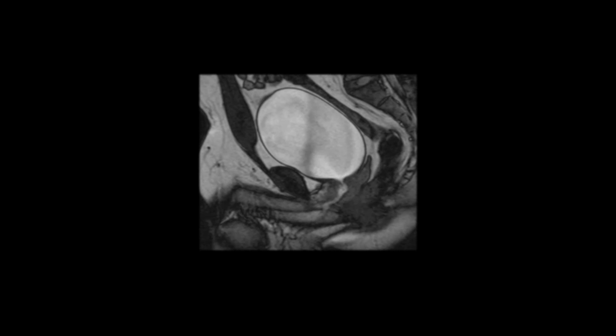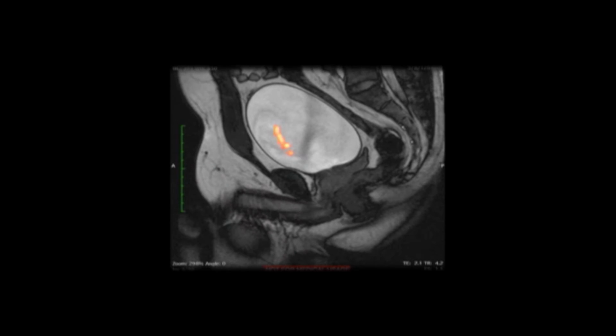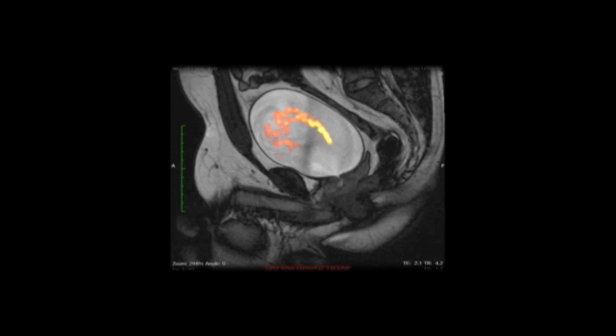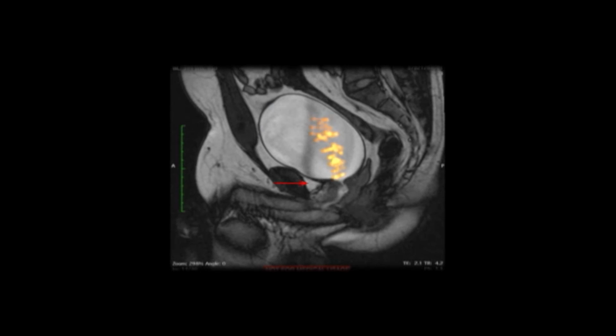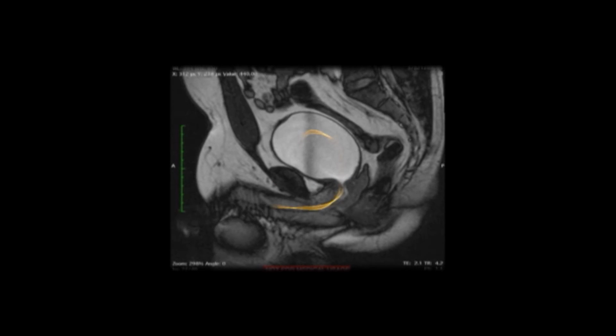Real-time MRI imaging was quite informative, as it showed not only the deformation of the bladder, but also the complicated clockwise vortex of the urine stream. We believe that this vortex cleanses the bladder and urethra to protect against bacterial proliferation.